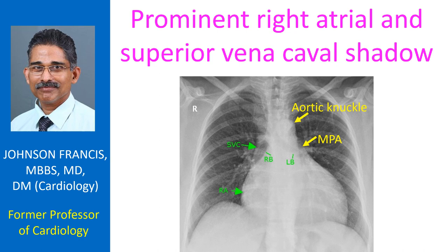Chest X-ray PA view showing prominent right atrial and superior venacaval shadow along with mild cardiomegaly. Right atrial enlargement is suggested by the rightward shift of the right cardiac border. The superior venacaval shadow can be traced upwards from the upper part of the right atrial contour.